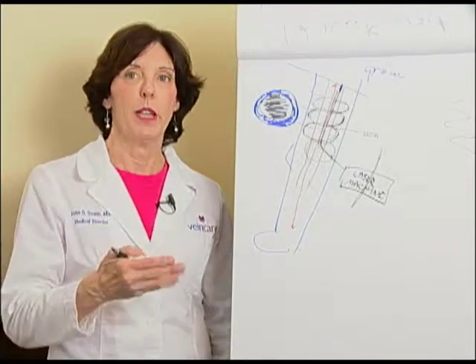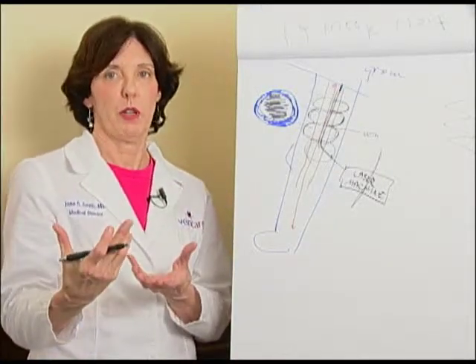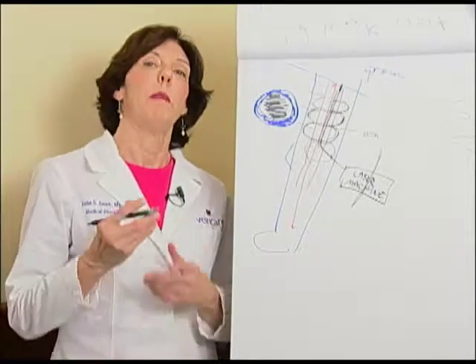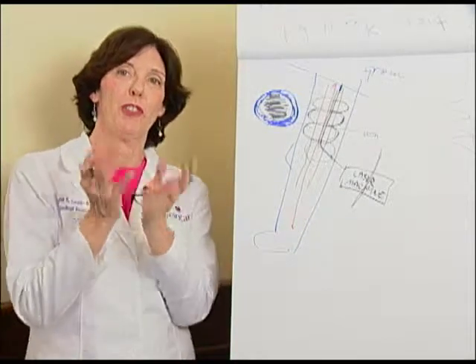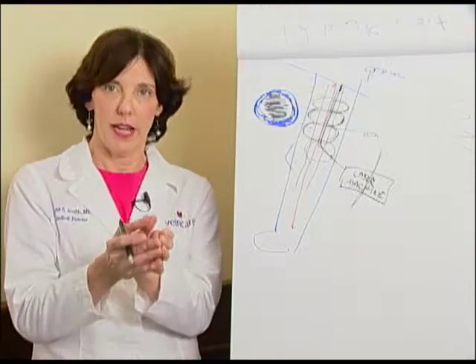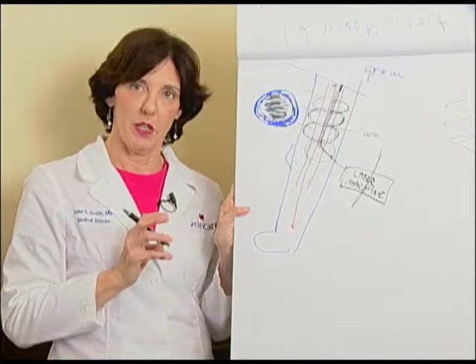Now, as you can imagine, the majority of this is the prep work. The actual laser, where I'm pulling back as I described, maybe takes a minute to a minute and a half. So honestly, a lot of this is boring. It's just the prep to do the procedure. And patients are always surprised when the actual laser part takes such a short period of time.